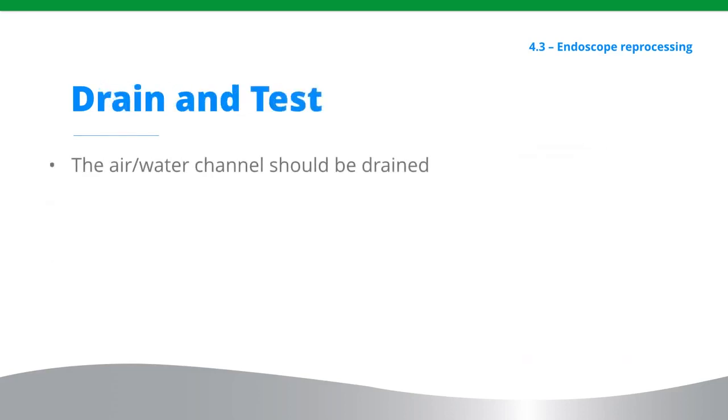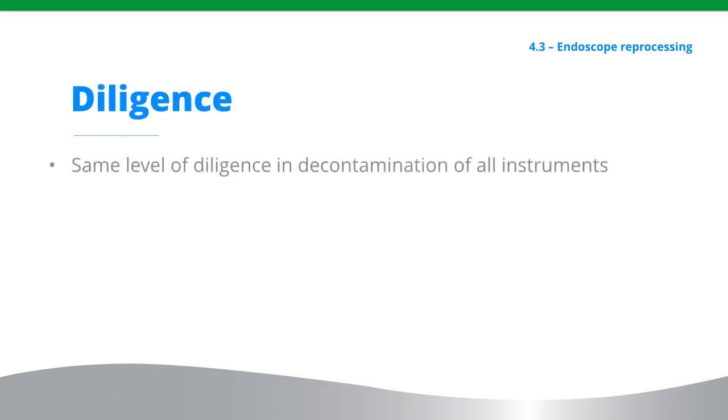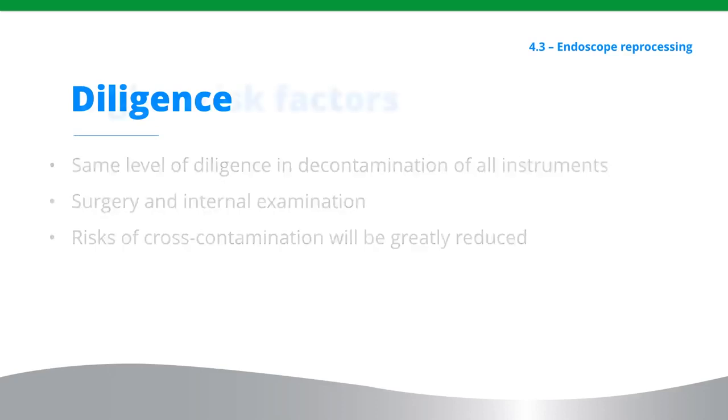The air-water channel should be drained. When all processes are complete and the instrument is externally dried, the instrument can be tested for image quality and stored in its special place under manufacturer's recommended conditions. If the same level of diligence is exercised in the decontamination of all instruments used in surgery and internal examination, the risks of cross-contamination will be greatly reduced.